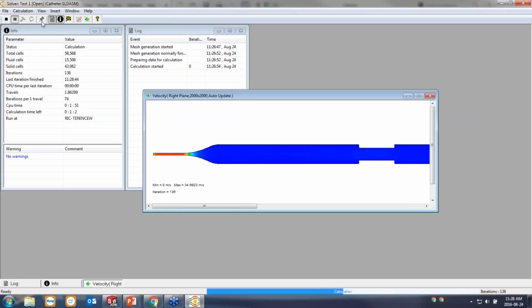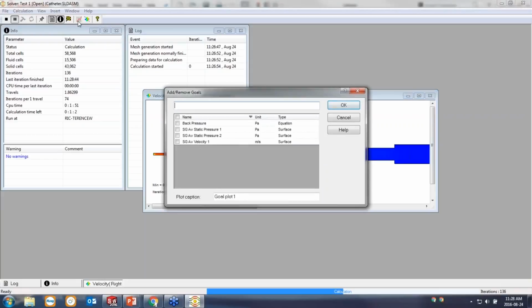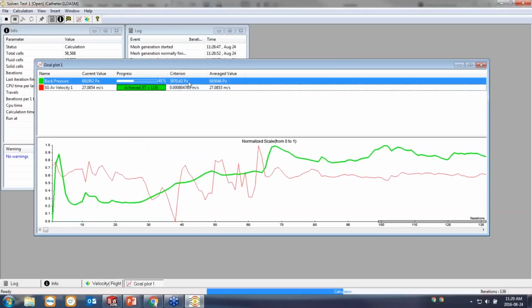Just going to pause this one more time. The other thing we can do in addition to our preview plot is we can take a look at a goals plot. So not only are those goals great for telling the software the values that are important to you, they're also great because you can take a look at these values while it's solving. And you can see that the exit velocity, that's already been achieved as far as convergence. It's a constant based on my flow rate.